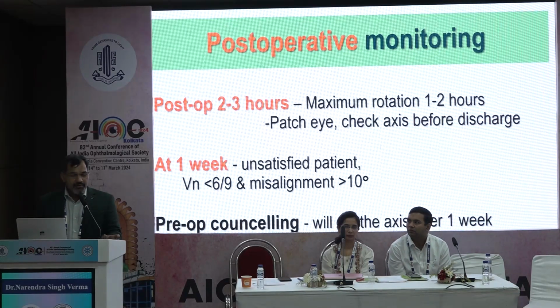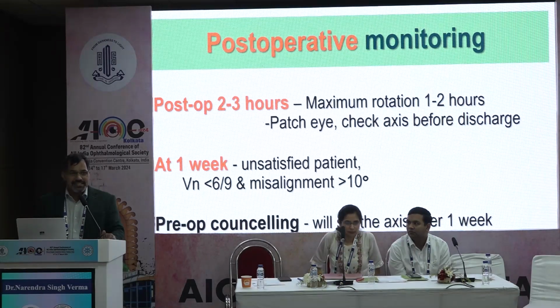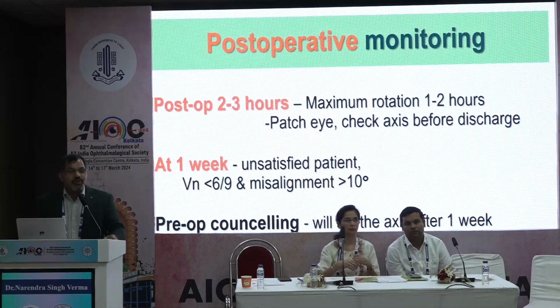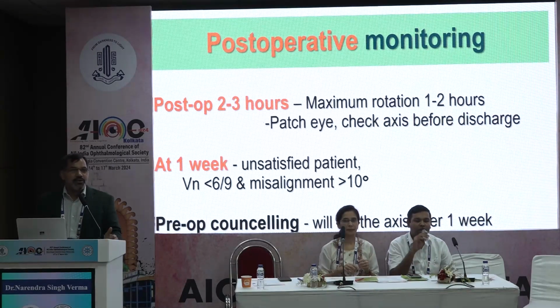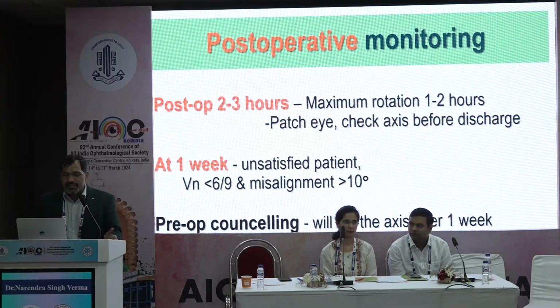And one thing I will tell you is that you can add one sentence in preoperative counseling: presently you are putting the lens and targeting the power, you are correcting the power, not correcting the axis. After 7 days I will take you to the operation table, and then I will adjust the axis. So if by chance there is a need for realignment, the patient will not think that you are doing surgery again because of some complication. You can add that sentence in the pre-counseling.